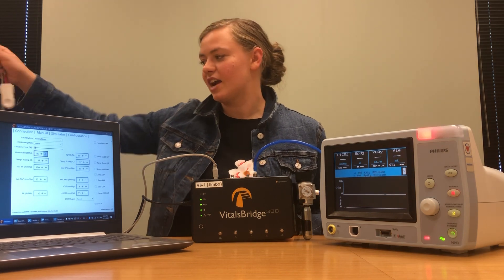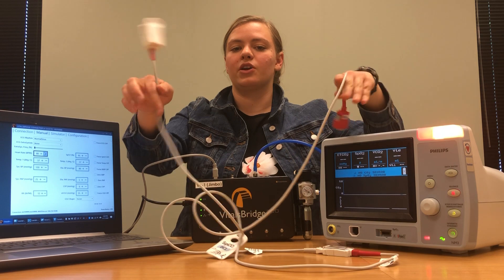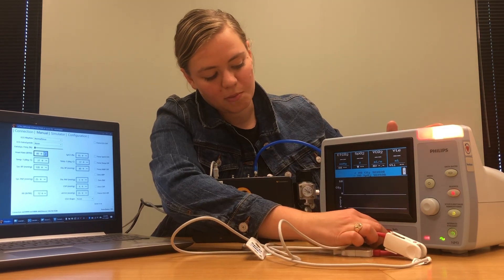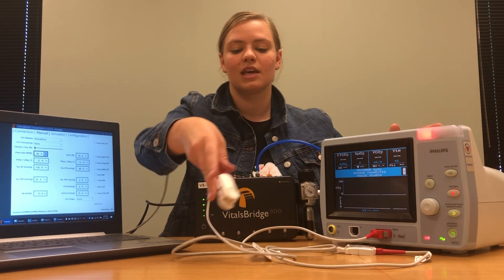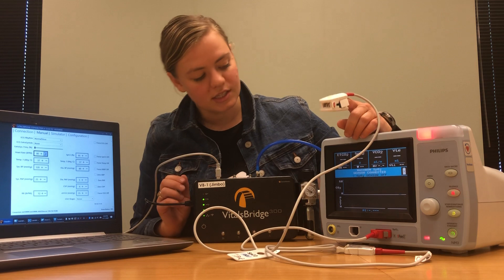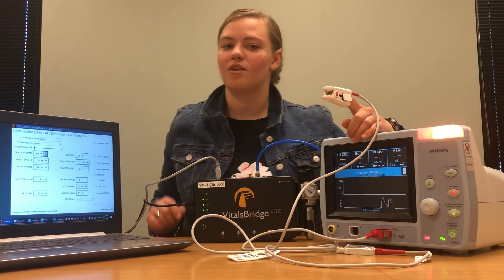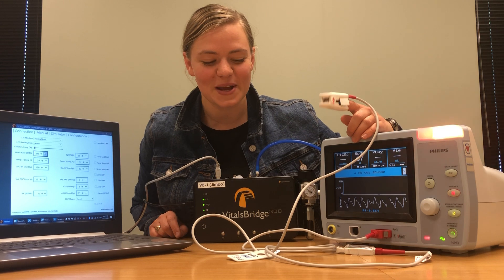The first thing we're going to connect is our SpO2 probe. The SpO2 probe for this Philips monitor looks like this. You've got one end that plugs into your patient monitor and one end that has a finger probe. Take the end that plugs into the patient monitor and snap it into place where it says SpO2. Then just to make sure everything is working properly, put the probe on your finger and you should see a reading of the SpO2 level, the pulse, and a SpO2 waveform appear on your monitor. And there it is — everything looks like it's working well.